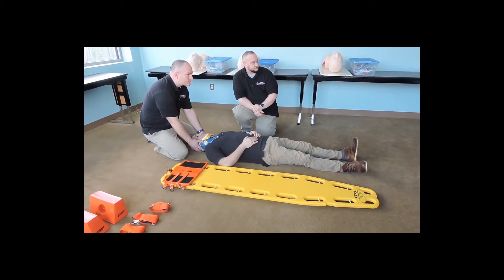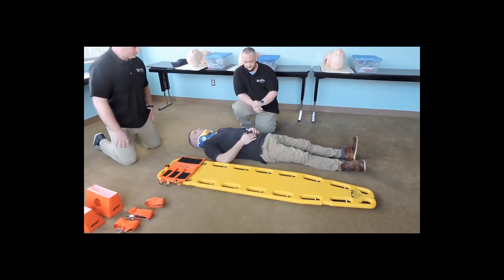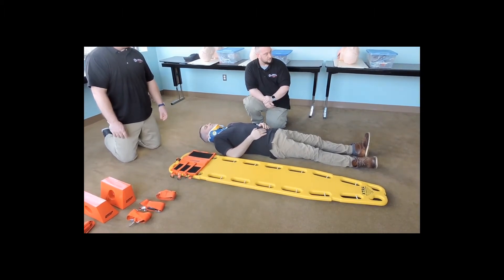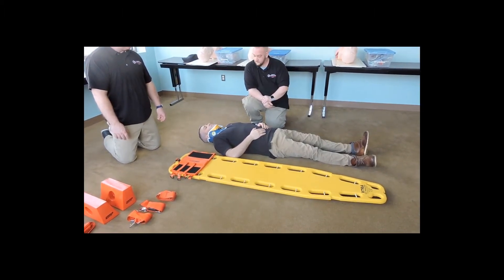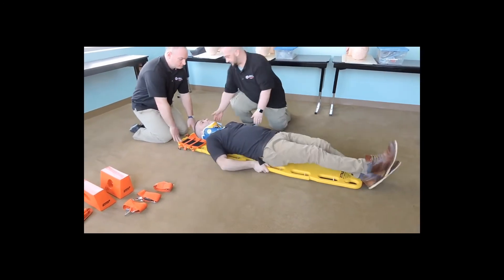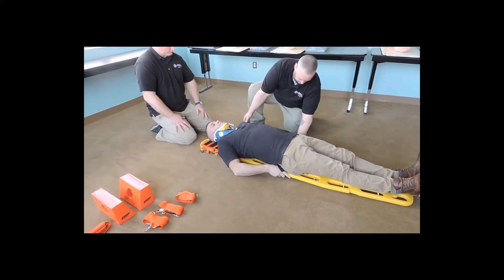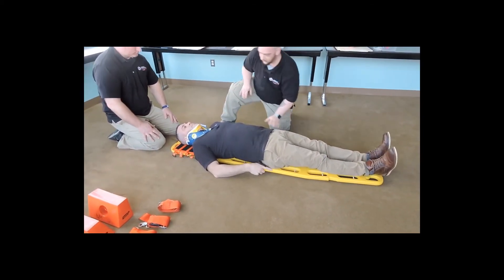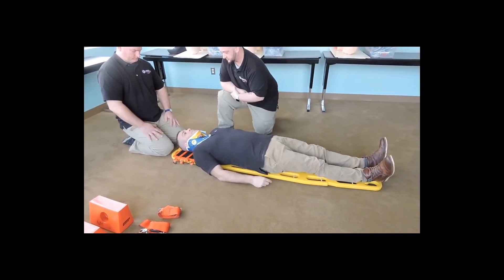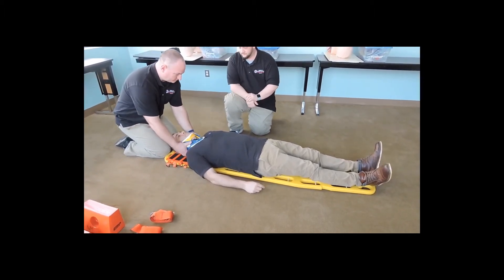At this point your partner can let go of stabilization. You can have your partner slide onto the board and adjust him up or down to where you feel he should be. When you're comfortable with where your patient is on the board, your partner can take up stabilization again. Scoot up for me. Moving the head over to the side — a little bit more center toward me, sir. Perfect. My patient is now positioned where I like him on the board. The partner can take up stabilization and continue the station.